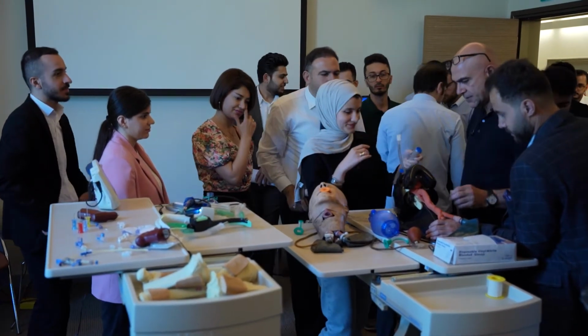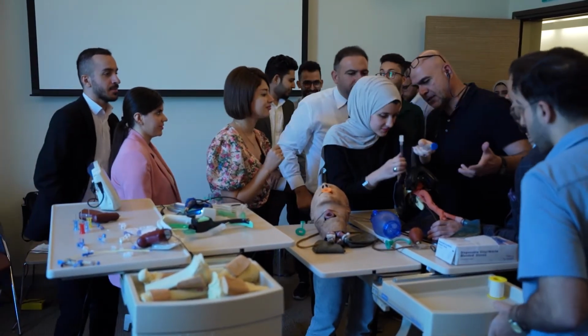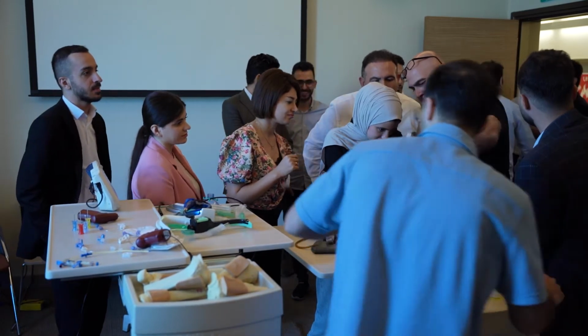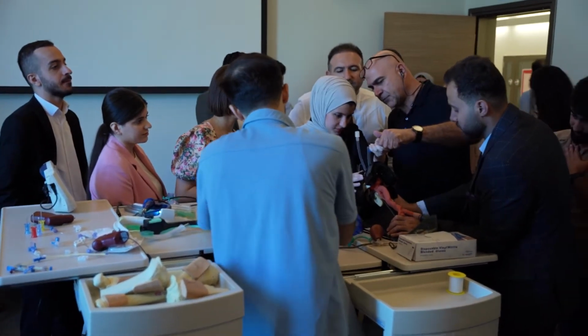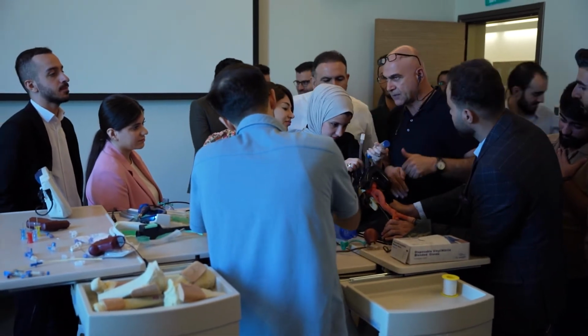Okay, good. Now we are going to just hold lots of the time. Exactly, make the larynx correct and try the tip of the blade just behind the epiglottis.